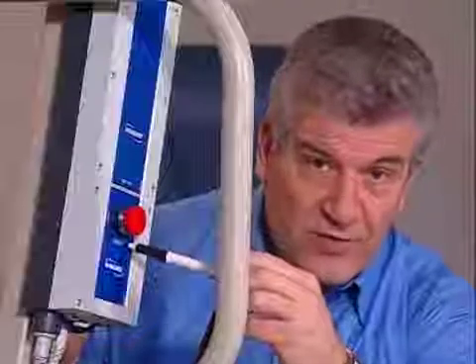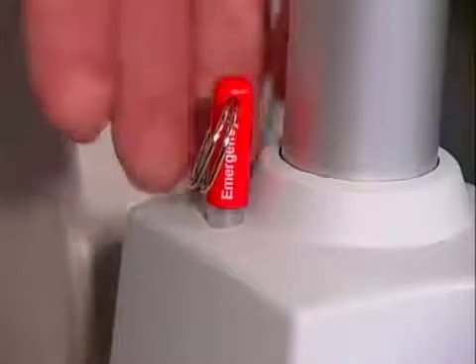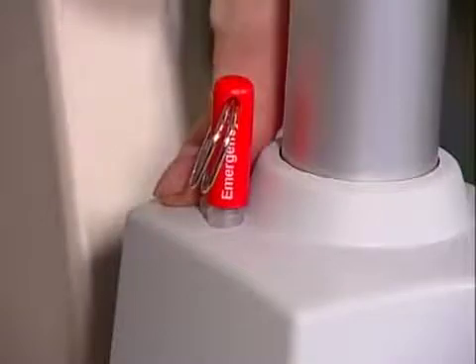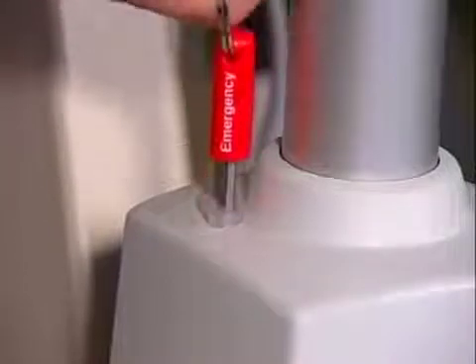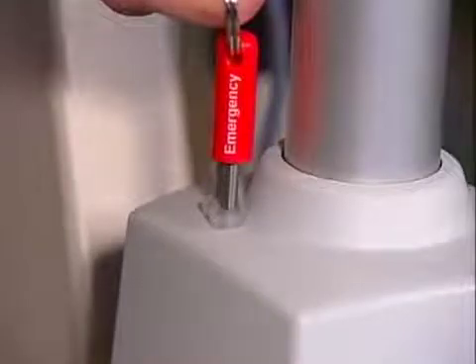If that doesn't work, or if you can't get to it, you can use the secondary mechanical emergency release, which is located here near the base of the actuator. To activate the secondary release, pull up on the emergency tab and push down on the boom at the same time. This will slowly lower the boom. There must be weight on the boom for this mechanical release to function.